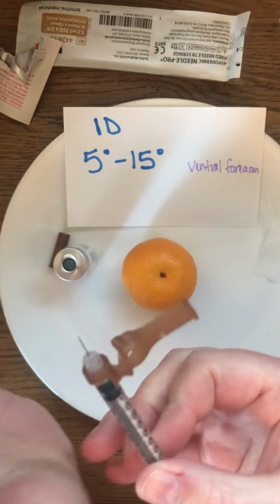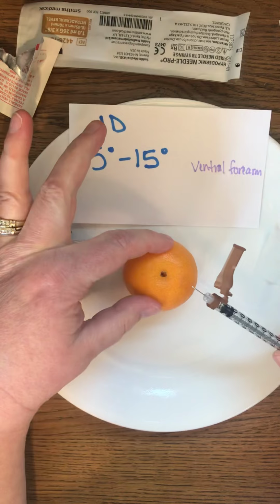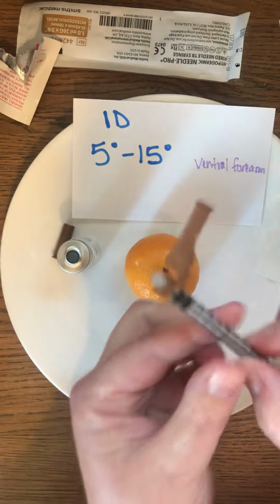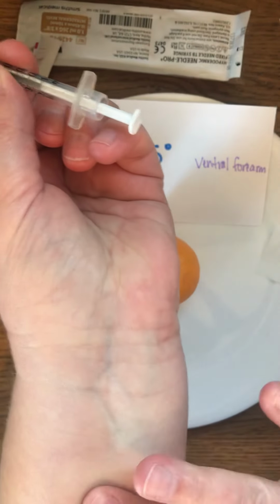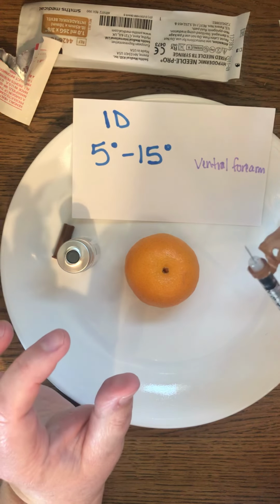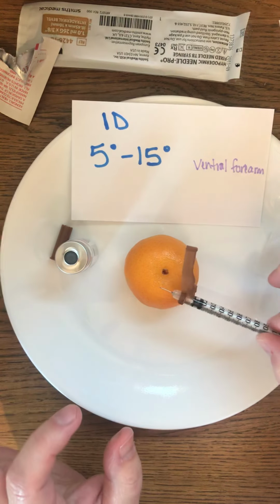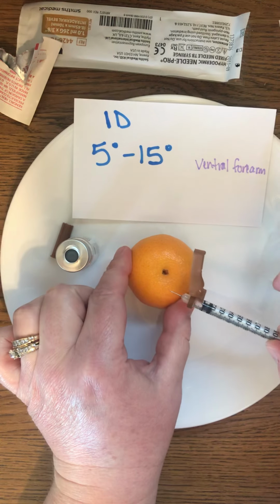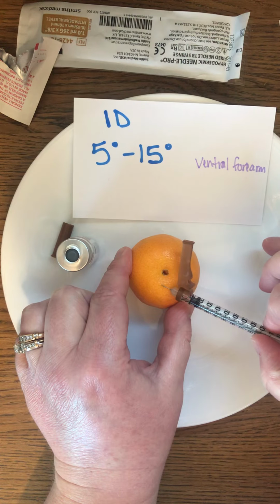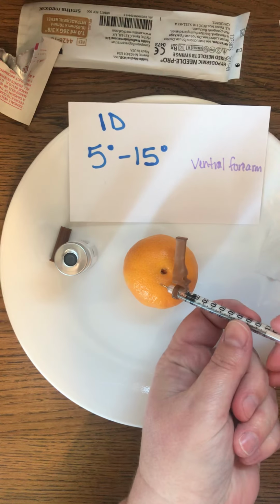I'm going to want to make sure I have my bevel up, and you're going to want to hold the skin taut. It's hard with an orange, but you want to have the skin pulled out and taut so that you can get in, because you're really only going to go under the skin just very little. Remember, the angle that you're going to go in is anywhere between 5 and 15 degrees, so it's not very much. You're not probably going to be able to see this, but you're going to go in just under the skin. Once you have it in place, you're going to hold it steady and inject.